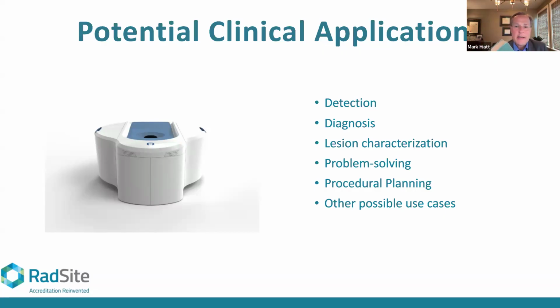What 3D acquisition allows, without reconstruction, but from the very beginning, acquisition, is slice by slice, so that you can thereby improve your sensitivity as you scan through the breast tissue. And so that's one of the key things that I understand as a radiologist, that it really helps me in having true 3D acquisition, which allows for true 3D visualization.